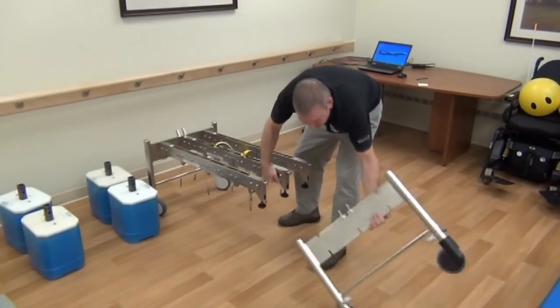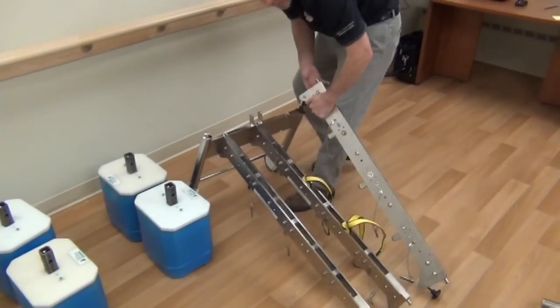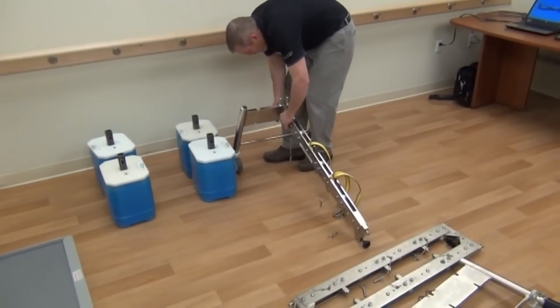The lift load is disassembled by removing the lever handle, loosening the six locking knobs on the load beams, removing one end frame, and finally removing the load beams while supporting the other end frame.